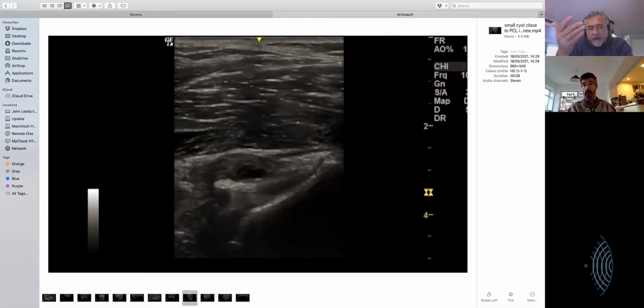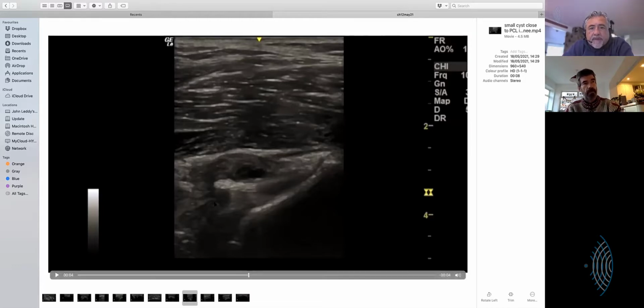And in essence, when they're on their tummy, you're cradling their shin, basically both to assess the level of tone that they have in their hamstrings and to take some of the tension off just to make it softer behind the knee. And then you bring yourself around from the medial joint line, and you go over the hamstring, and you keep the edge of the tibia in view until all of a sudden it takes the angle like this, and the fibers that are coming out are your cruciates, your posterior cruciate.